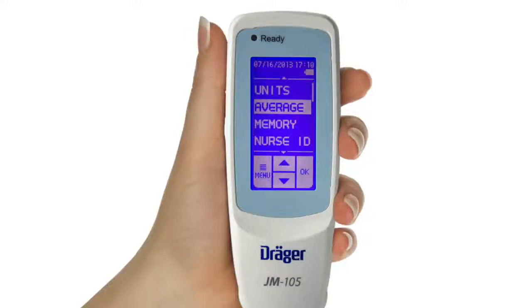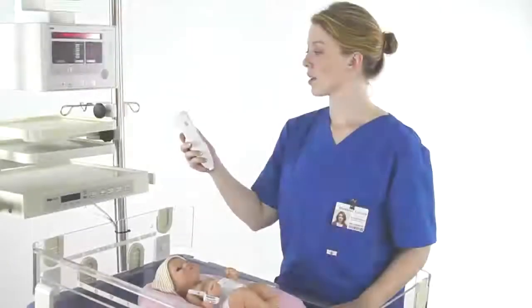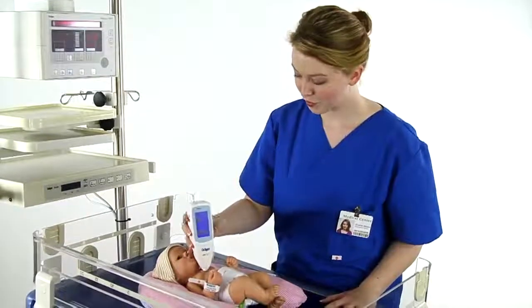Returning to the configuration screen, select Average. This feature allows you to select the number of readings you will take, meaning the number of times you will touch the probe to the baby's skin, and the device will average these measurements.